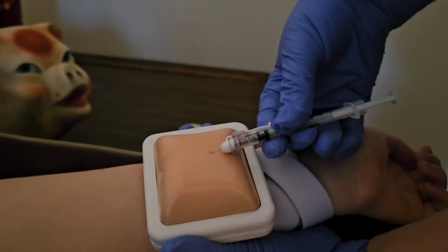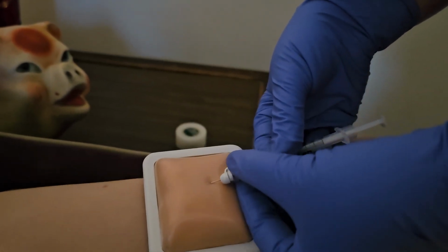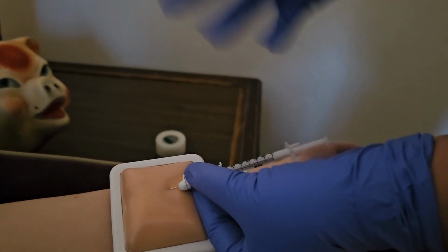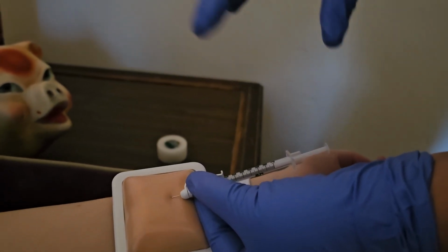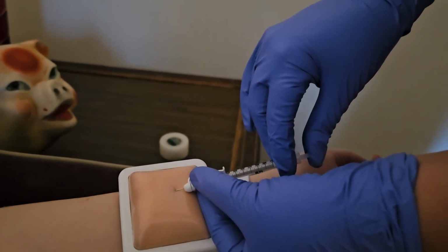Okay, now with our non-dominant hand, we're going to stabilize the bottom of the syringe. And with our dominant hand, we are going to push in that medication.